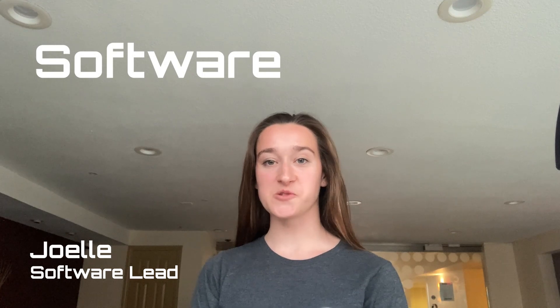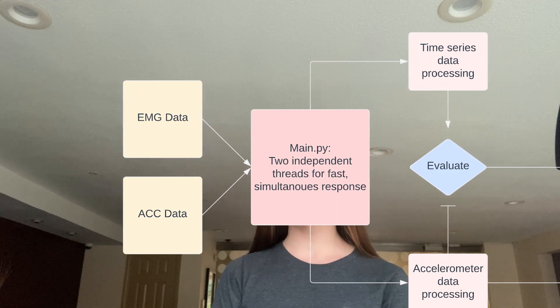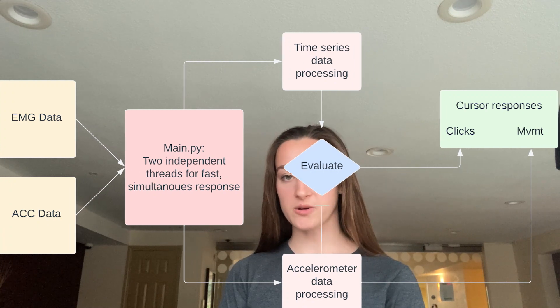At the heart of our system is robust and efficient software which interprets both accelerometer and time series data from the EMG armband and translates them into accurate computer control. In our main file, we use an LSL stream to get EMG data from the electrodes and hand acceleration data from the Cyton's accelerometer. Each stream is fed into its own thread where sampling, processing, and GUI calls can occur independently. This optimizes speed and synchronization of the cursor outputs. Each thread follows a similar pipeline: data is pulled, processed, and its output calls a change to the cursor — either movement or a click — via the PyAutoGUI package.